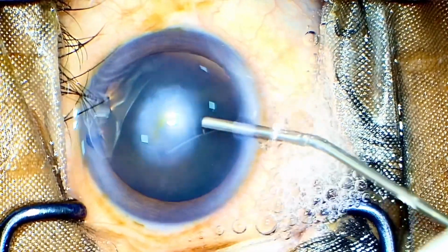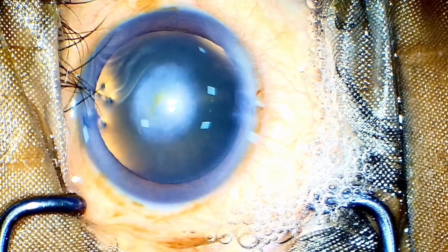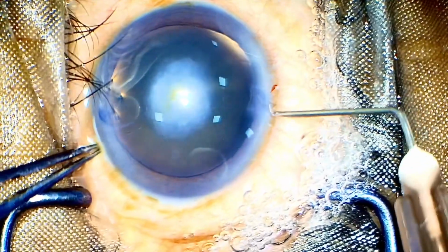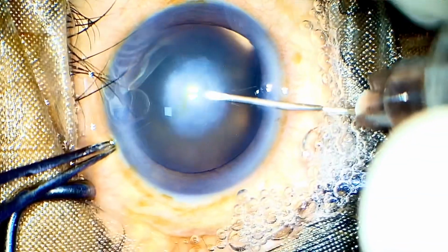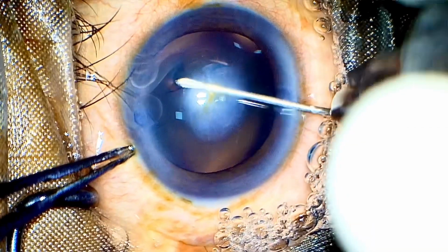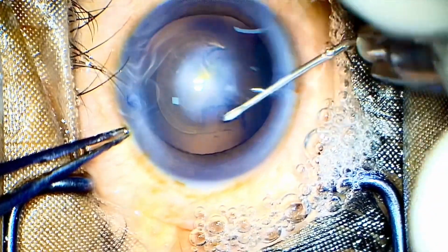There are a few points to note which are important in this case, and yes, you can see the central corneal opacity. As far as I remember, the patient had a history of trauma since he was a kid and did not have the budget to go around having an optical PK sort of thing. So I decided that I'll go ahead. The things to note are just two simple things. It will be a simple case.